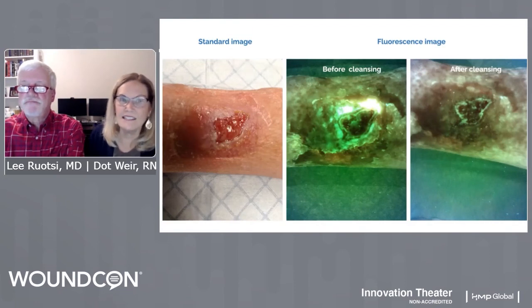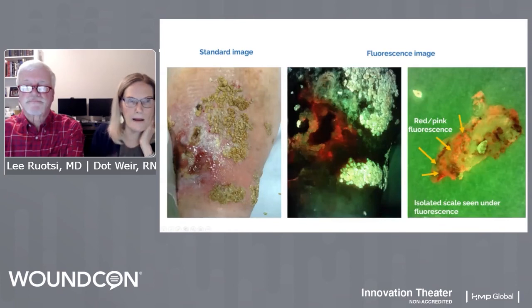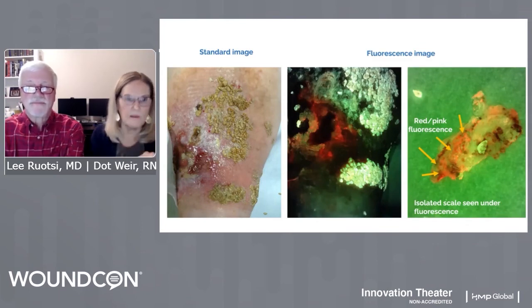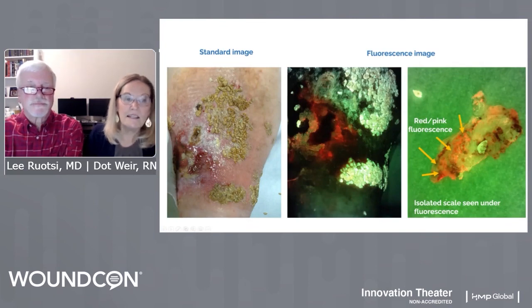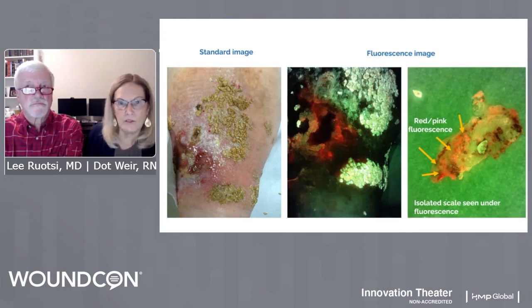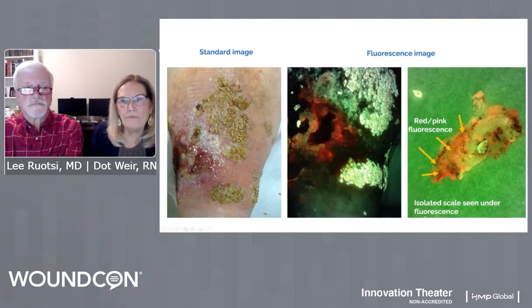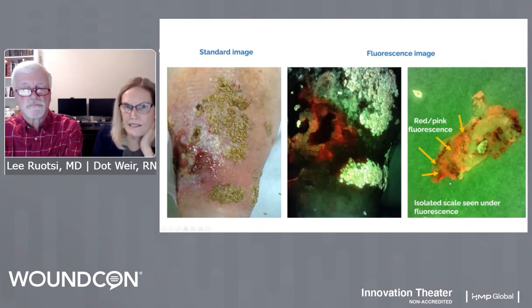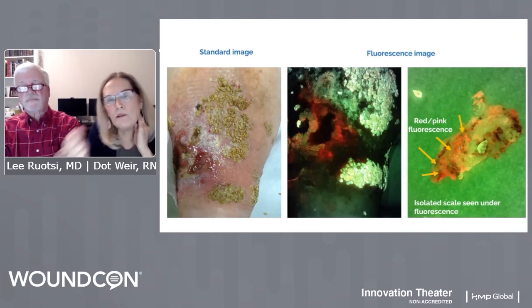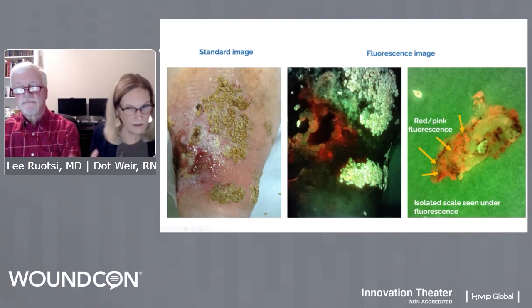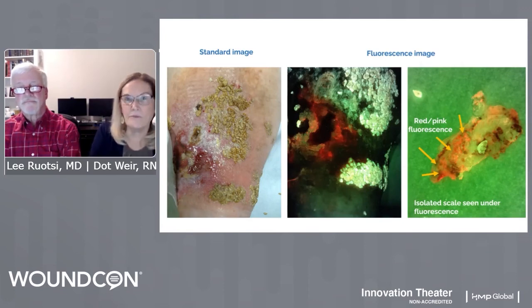When I interview nurses to work in our clinic, I ask if they like to pick scabs and scales — if they say yes, that's a big plus, because we have to get rid of these things. This gentleman's entire lower extremity had thick crusty scales. You can see in the imaging that dry skin shows up green, but there was a lot of fluorescence around the periphery of the wound. This is a scale I peeled off — this is why we need to get rid of them. They are harboring bacteria. If you peel off one of those waxy scales, sometimes there's little maceration underneath. We have to get rid of them, and when people come in with a lot of scales, it may not happen in one visit, but it's something we should work toward.